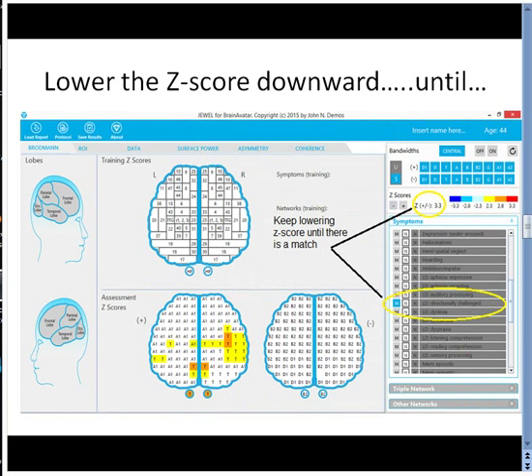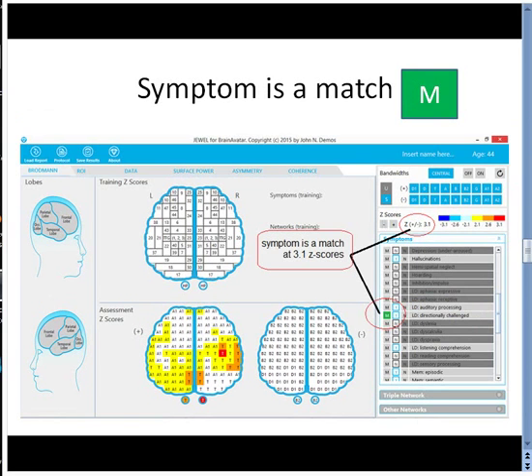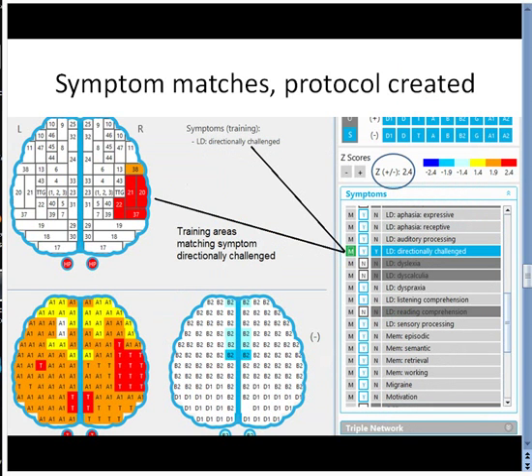We now begin to lower the Z-Score until there is a match. There's a match — I've lowered the Z-Score to 3.1. The M button turned green, and consequently the symptom of choice was matched. Once the symptom is matched, the protocol is created. I also lowered the Z-Score just a little bit so that specific training areas could be picked out.